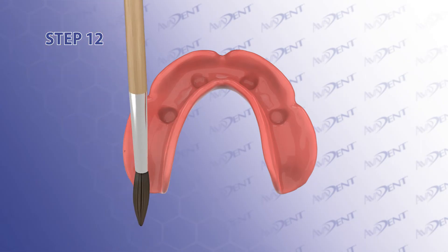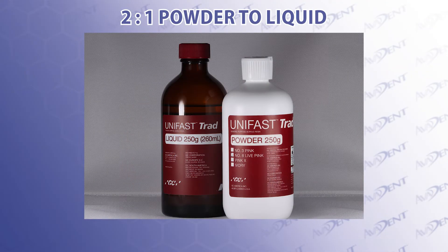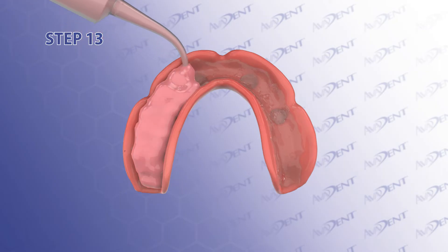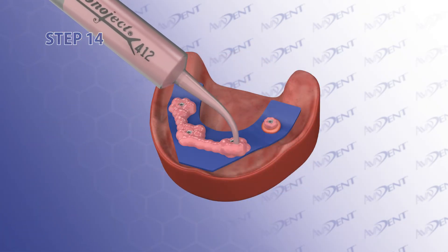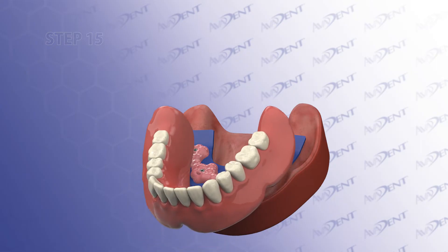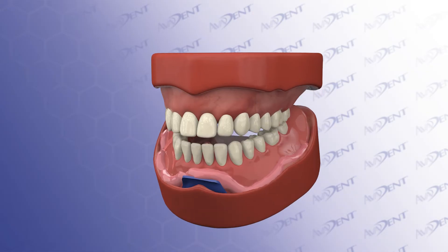Step 12. Prime the intaglio surface of the AvaDent denture base by painting monomer to the intaglio of the denture base. Mix the powder and liquid with a 2-to-1 ratio and backfill into a monoject syringe. Step 13. Inject the mixed acrylic pickup material into the denture and overfill while the material is more liquid. Step 14. Inject a small amount of acrylic around the tie bases. Step 15. Seat the denture over the tie bases and guide the patient into proper occlusion. Step 16. Maintain the teeth together while the material sets up. During the setting phase, be sure to irrigate occasionally to control the exothermic reaction of the pickup material.